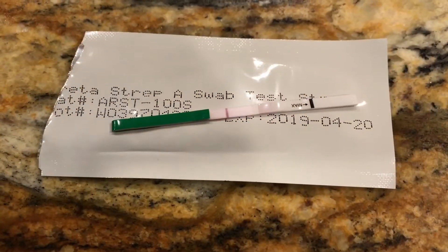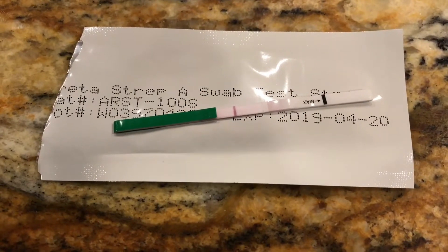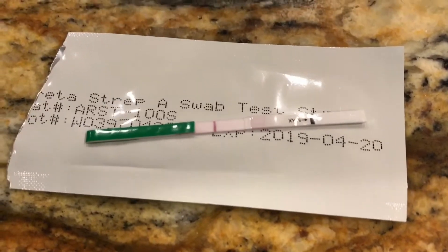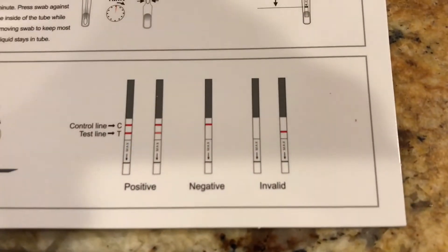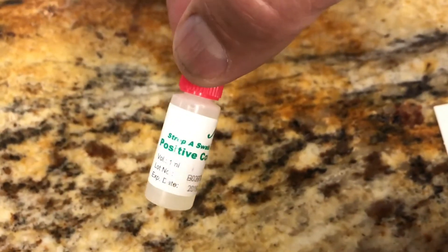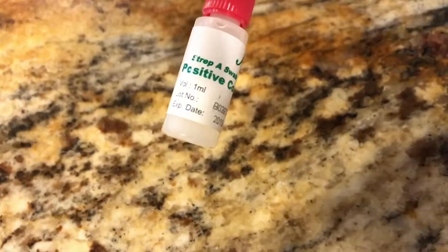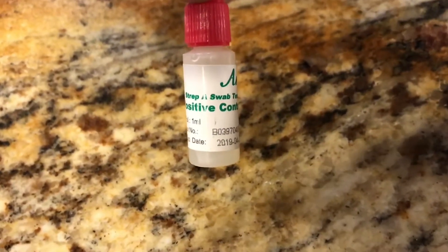So this was a negative test. Notice I didn't put the strip on a sponge — you don't want anything that's going to wick away the fluid. That little test strip is absorbent, and if you put it on something else absorbent it could pull away the sample. Again, you want to see two lines if it were positive. Now just for fun, I read the insert while waiting — there's a positive control. Instead of swabbing his throat, I put three drops of this into the bottle to test that the operator and kit are working properly.